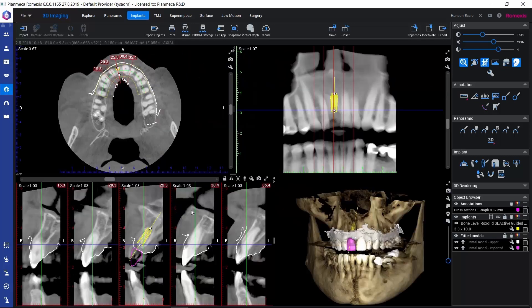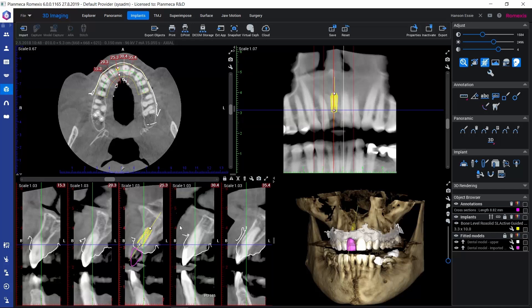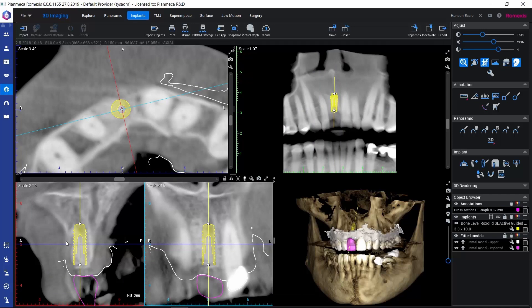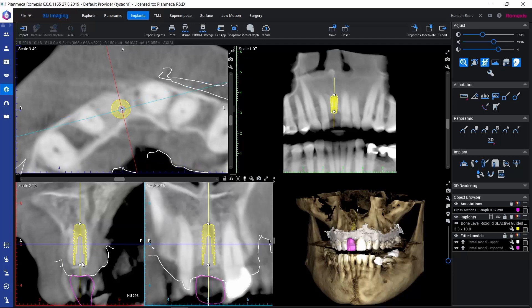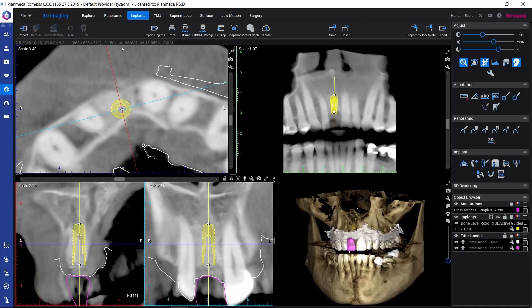But the view that we really recommend for adjusting the positioning of the implant is this implant-centric view. When we have the implant that we want to reposition activated — so it has these control points and it's bolded in the object browser — we can click here on this implant-centric view icon. This generates views that are centered on the implant. In the axial view, we can see the two views below: the light blue view is parallel to the panoramic curve, and perpendicular to that we have the red view. These views always stay centered on the implant, so if we grab the implant and reposition it, these views will always stay centered on it.